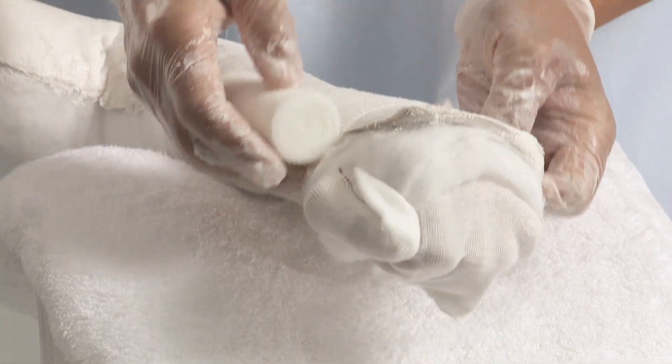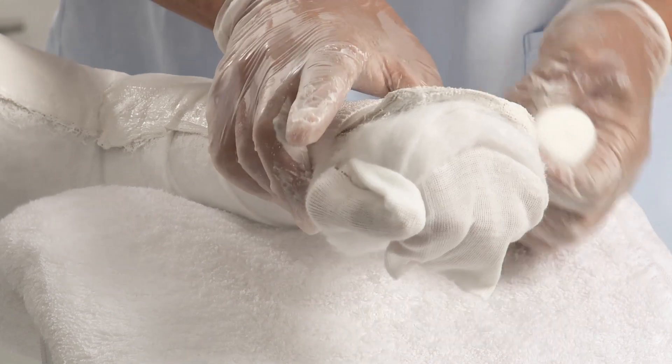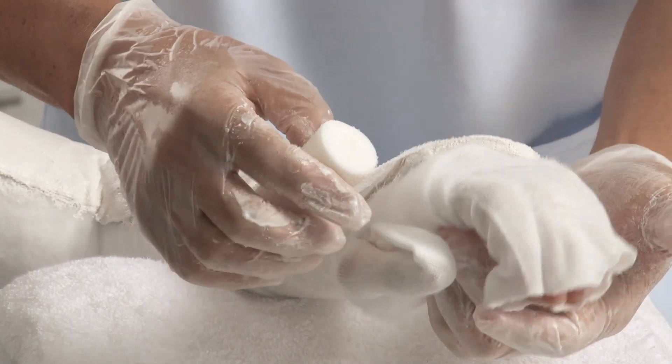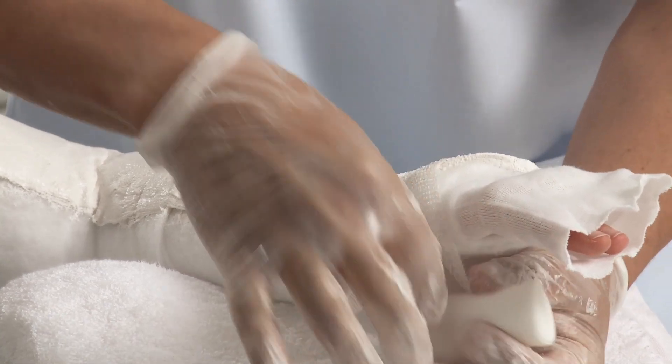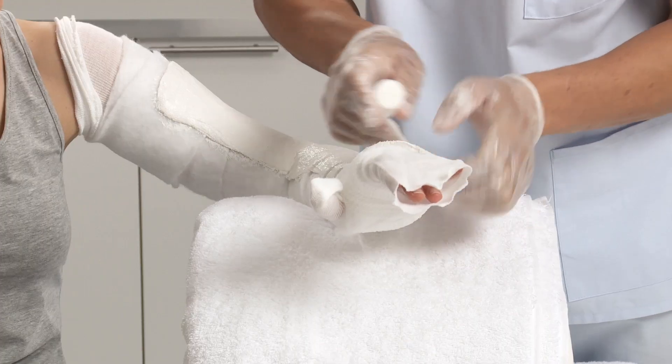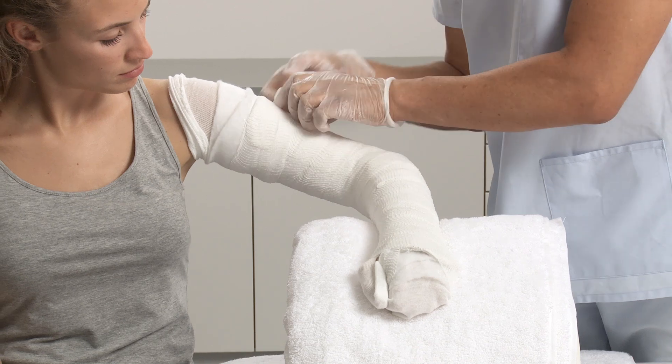To secure the splint, wrap with the bandage starting at the hand, passing through the web space once. Continue wrapping going proximately, overlapping the bandage by 50%. Cut the bandage and secure.